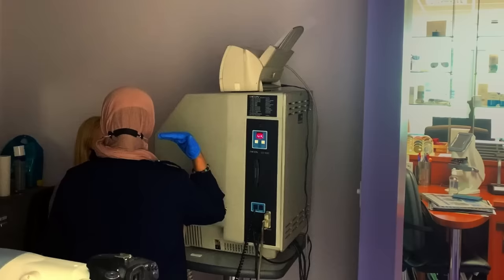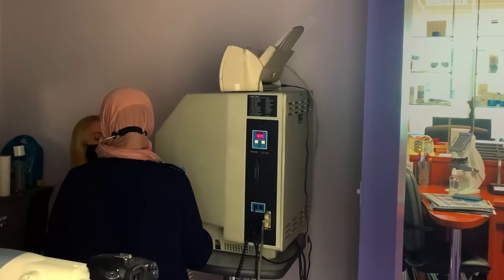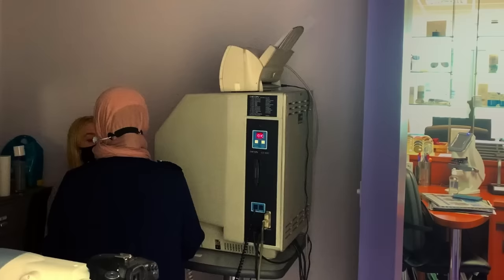So your retina is sensitive to different levels of light. In certain diseases, those levels go down, or you get parts of your visual field that are missing. So what we do is we do a visual field test for everyone. In your case, because it's the first time we've met, it's like a base reading. And then every time you come to see me, we'll always compare. Okay, so I'm going to set you up.